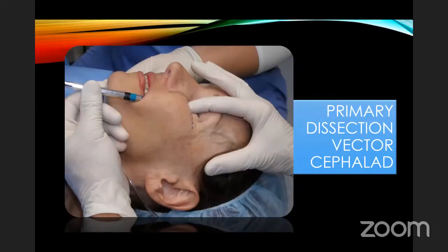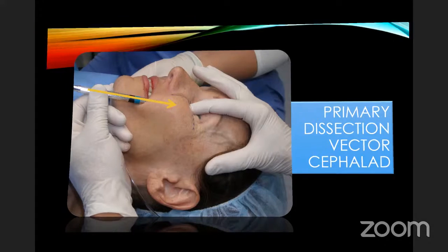So when we begin our dissection, we put the periosteal elevator in, and we go right to the bone. We want to be subperiosteal, and I will dissect several millimeters superior. At this point, I need to be cognizant of the infraorbital nerve.